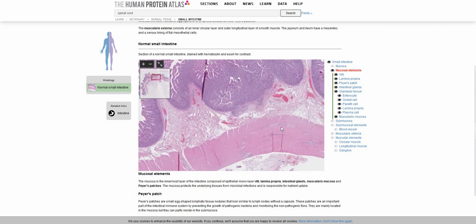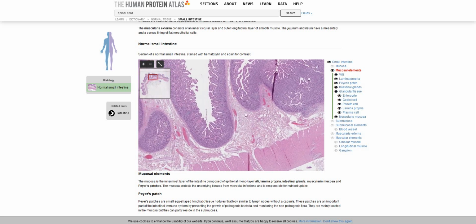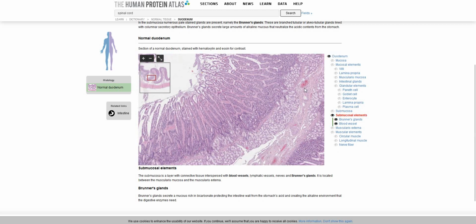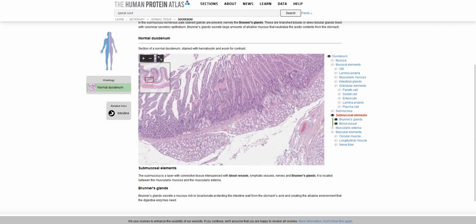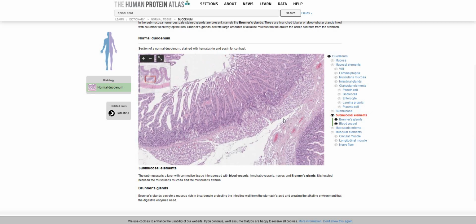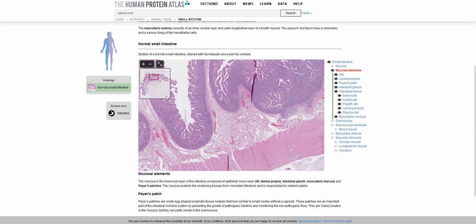To review, the small intestine has 3 regions. The first and the last region have unique features, but the middle region does not. When you're looking on your slide, how you know you're dealing with duodenum is if you see this really busy submucosa with many, many Brunner's glands. I'm going to skip over jejunum for now.